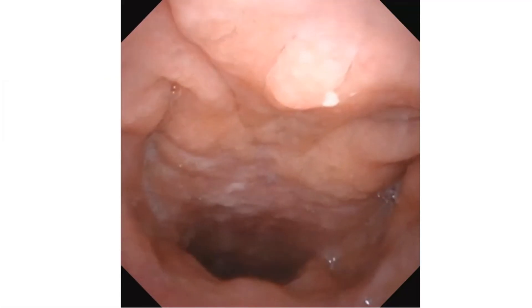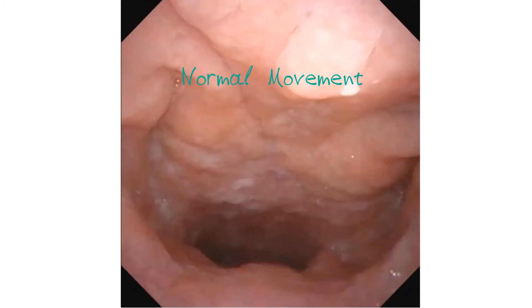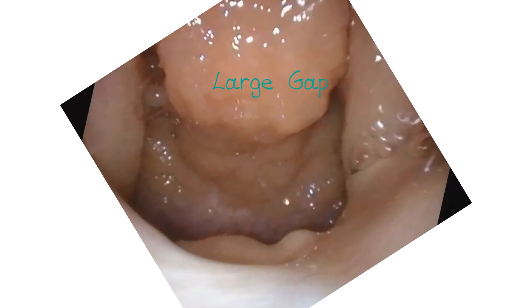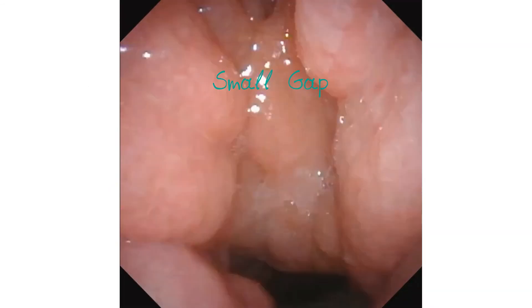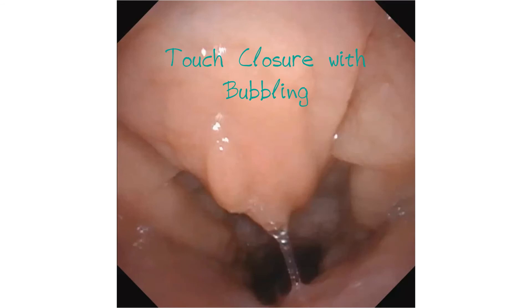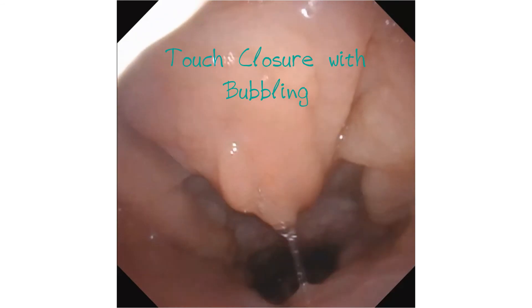If we look as the child speaks, you can see the soft palate lifting against the throat and making good contact. This is a normal movement pattern. Here is an example of a palate that is lifting but not making contact, with a large gap. An example of a palate that is nearly making contact but has a consistent small gap. An example of a palate that is just about touching, but doesn't have the force required to create a good valve system. You can see the bubbles as the air forces its way through the valve.